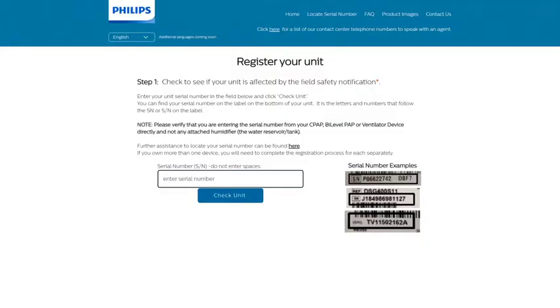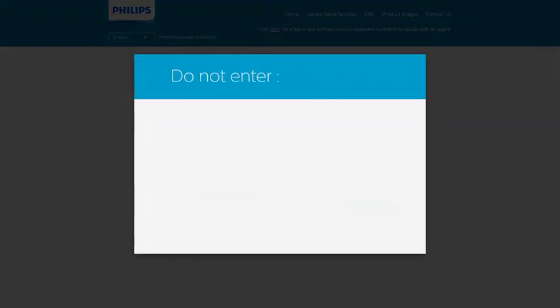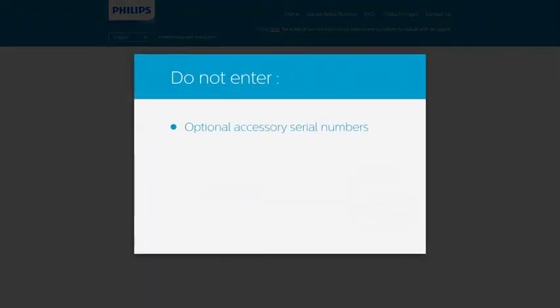Enter your serial number that is on your device to see if your unit is affected. Please be sure not to include the letters SN or any spaces. Do not enter optional accessory serial numbers.